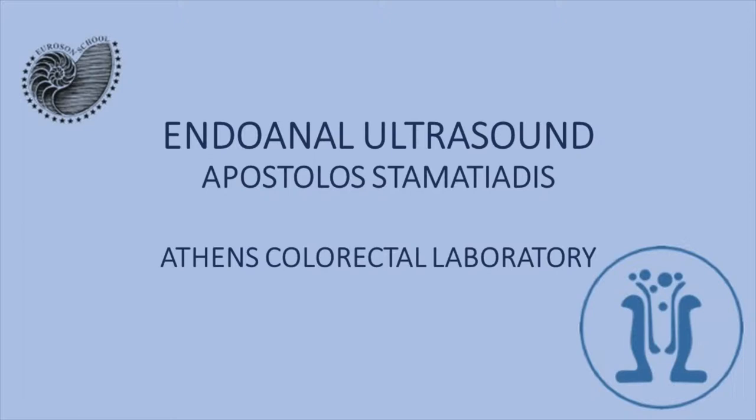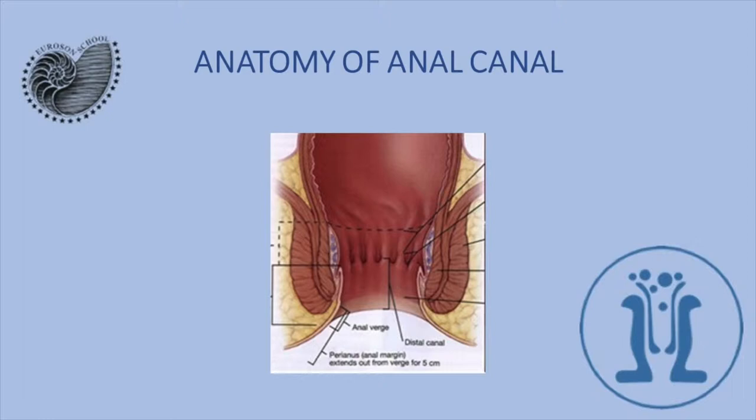Here we see the anatomy of the anus and of the anal sphincters. Here is the internal anal sphincter, it's the second layer around the anus, and this is the external anal sphincter. And this is the perianal and rectal fat, and here is the rectum, here are the sphincters, and here is the anal verge.